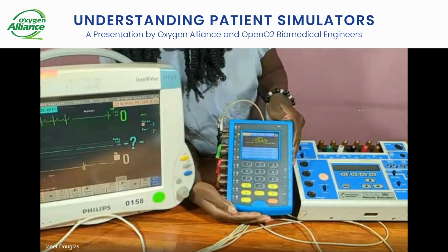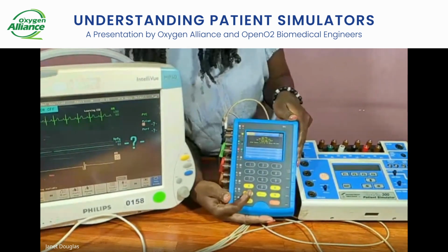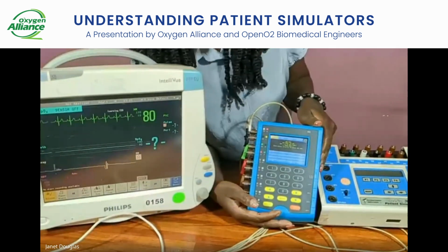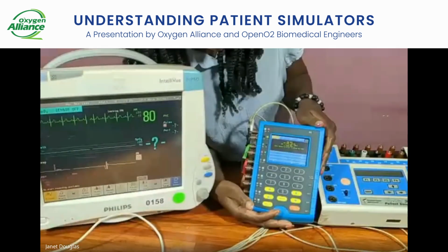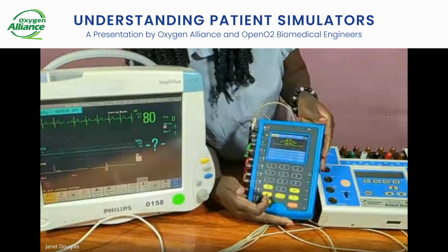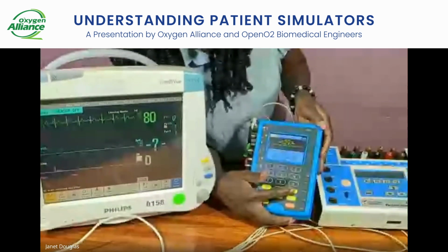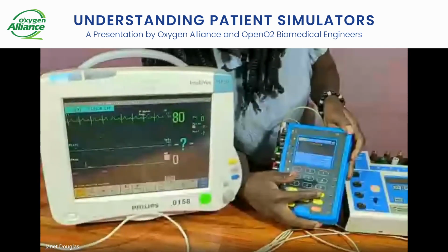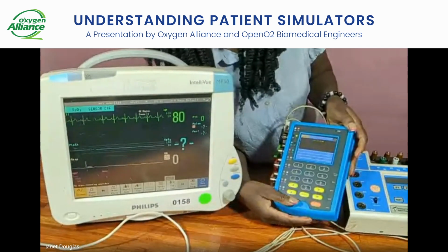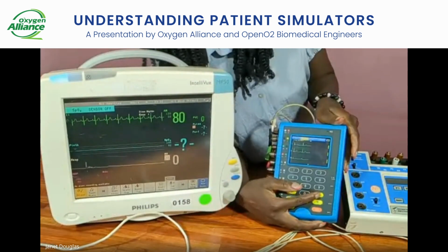So when you get here for this model, it will show you the keys, and the keys are the same keys that we have here. But since this one has a touchpad, you can also use the keys on the LCD. When you use these arrow keys, there is the down, up, and the sideways. If I go to the left, it's giving me different numbers: 1, 2, 3, 4, 5. But then I can choose to clear this and also move to the other tabs.